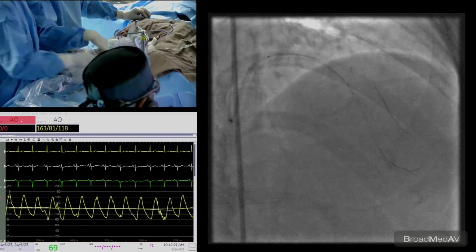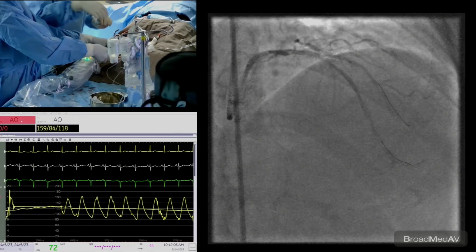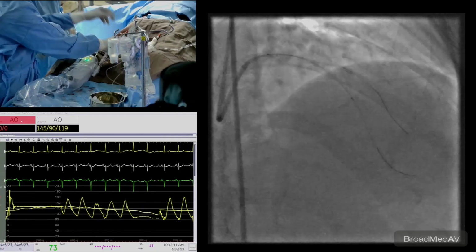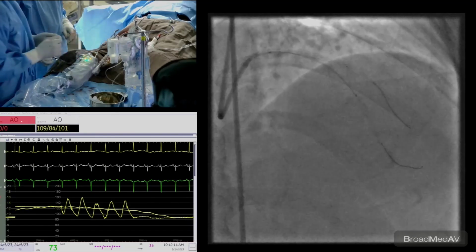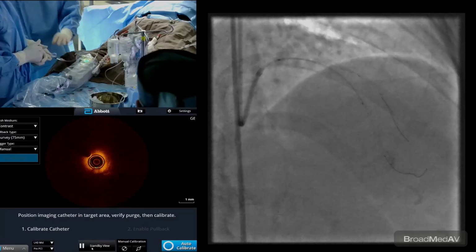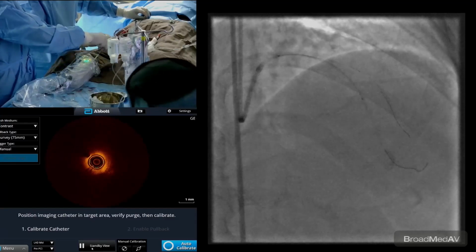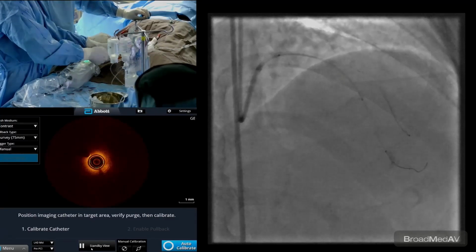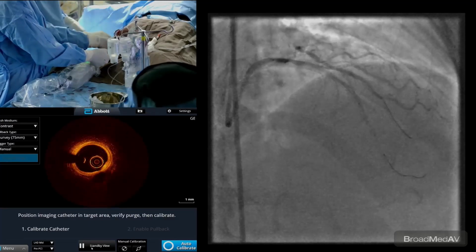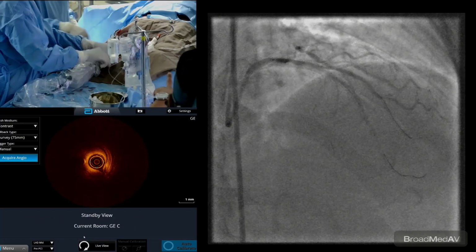Flush, please. Yeah. Good, that's fine. And can you flush the OCT catheter? I will check the catheter clearance. Yeah, check the clearance. Is it flushing? No, it's not clearing. Okay. Nicely. Yeah, central lumen is clearing. Can you flush the guide catheter? We see slightly more dye. Yeah, very slight dye. Okay, now it's clearing. Okay, right. So please open the port of the power injector.